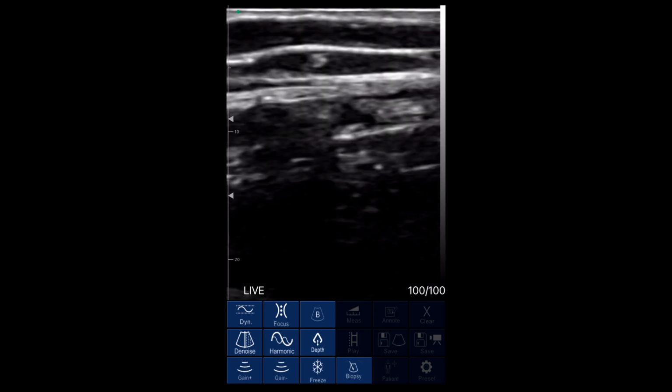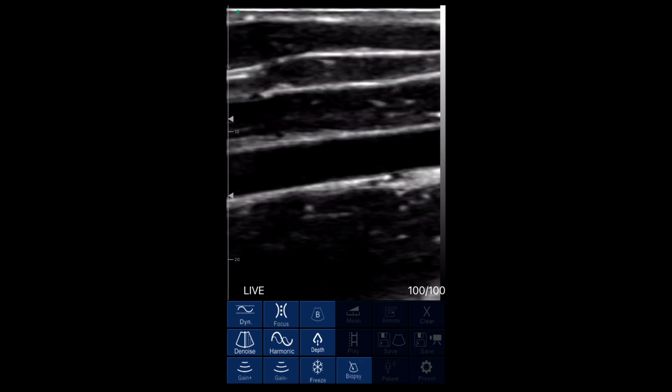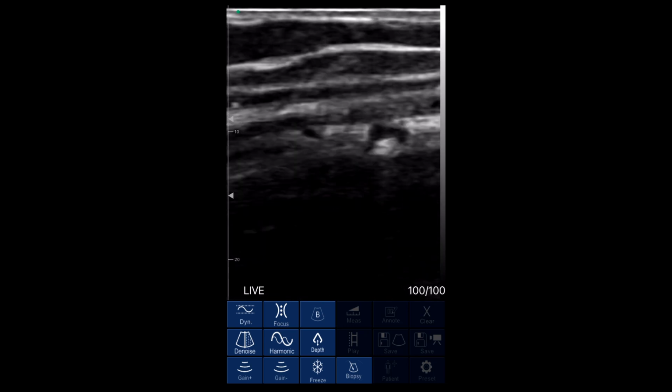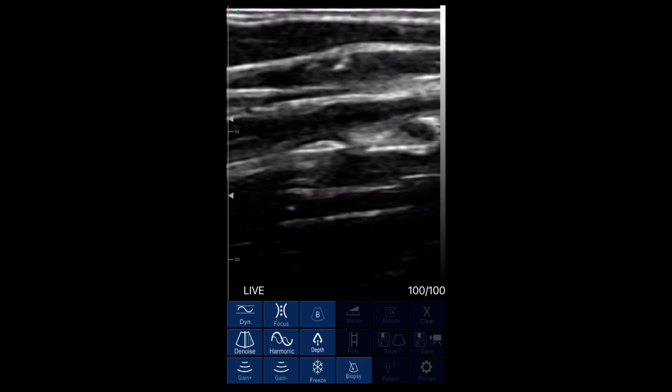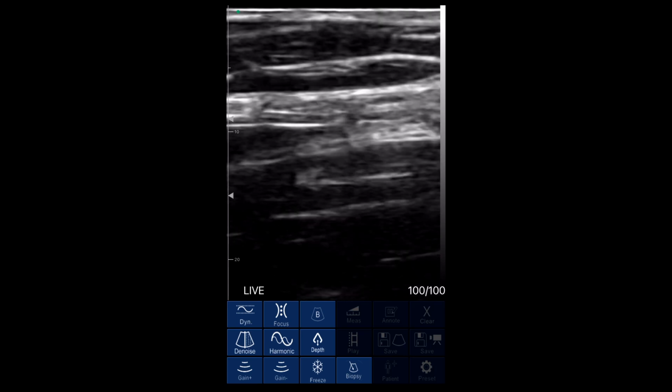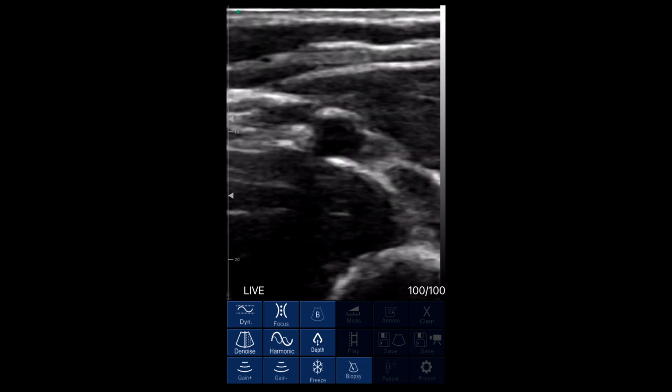I just decreased my depth so that we could get a better look at that vessel. You can see the walls really, really clearly. You can see the inside of the lumen, and I'm going back and forth between the artery and the vein to show you how easy it is to maneuver the probe. And then now we are back in transverse.